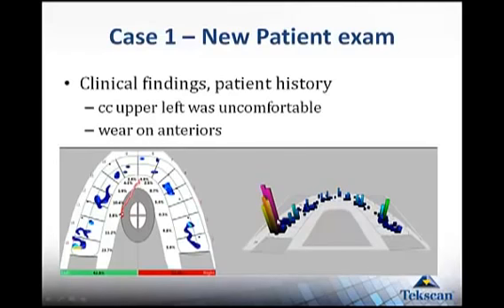And this was actually a restored crown that was done, I believe, 3 or 4 years ago. And this patient came to this doctor as a new patient. So this was a restored crown. And just to give you a future of what he ended up finding there, he found that that actual tooth on 15 was actually cracked. So he had to replace that crown.